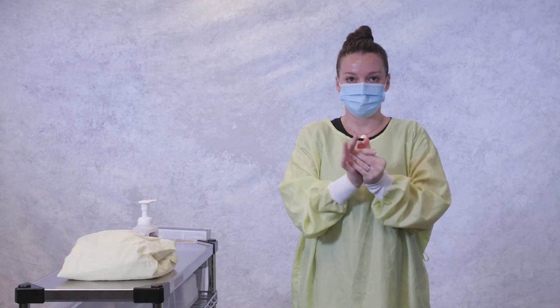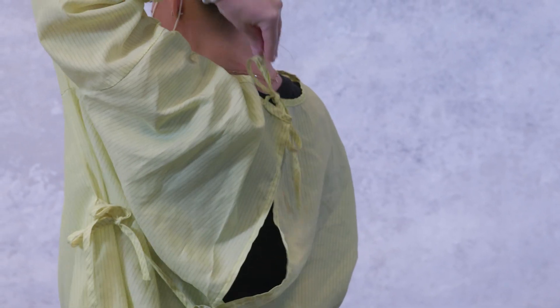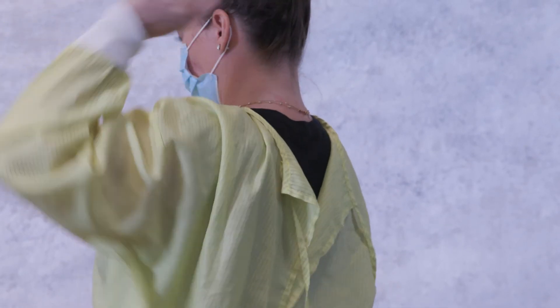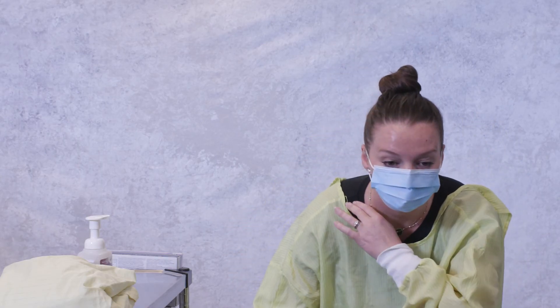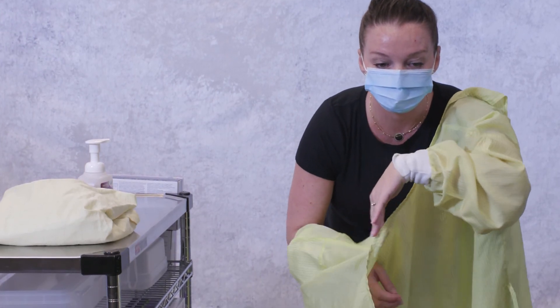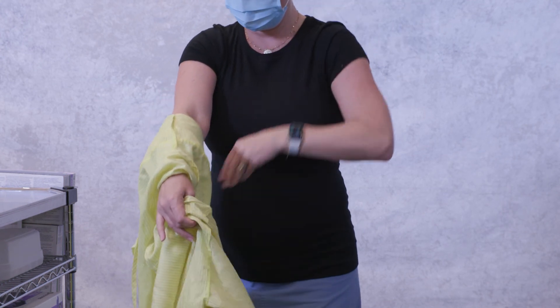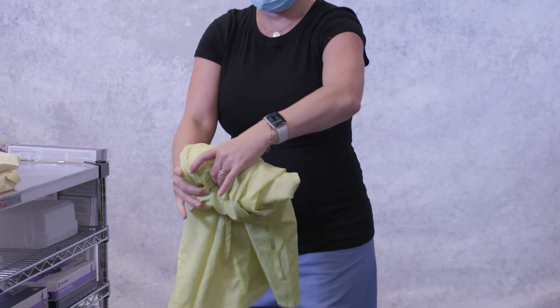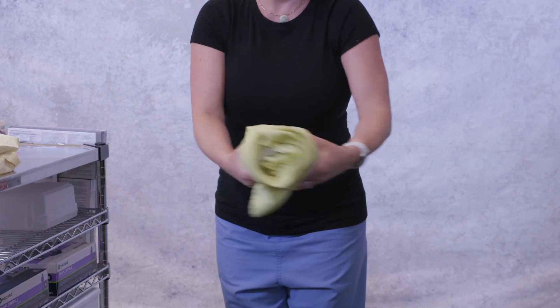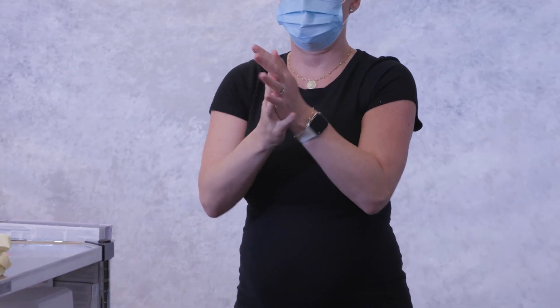To remove the gown, reach behind your neck and untie the ties. Reach behind your back and untie the waist ties. Lean slightly forward and pull the gown away from your neck and shoulders. Roll the gown into itself, touching only the inside. Discard the gown in a laundry bin. Perform hand hygiene using alcohol-based hand rub, remembering to rub until dry.